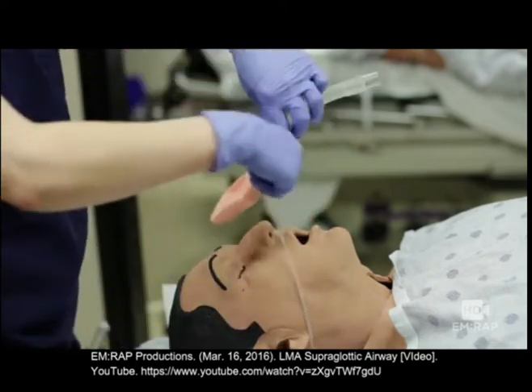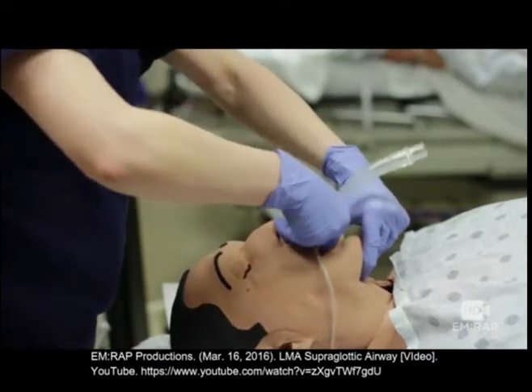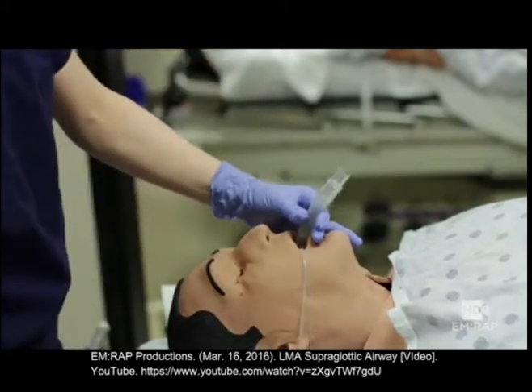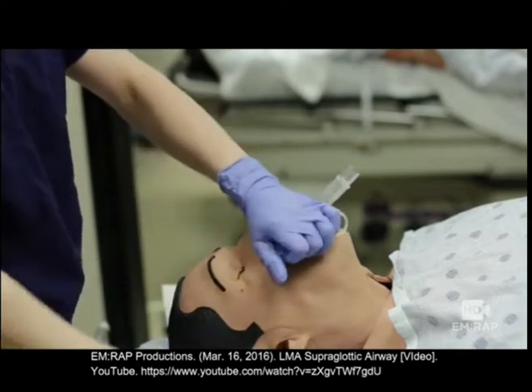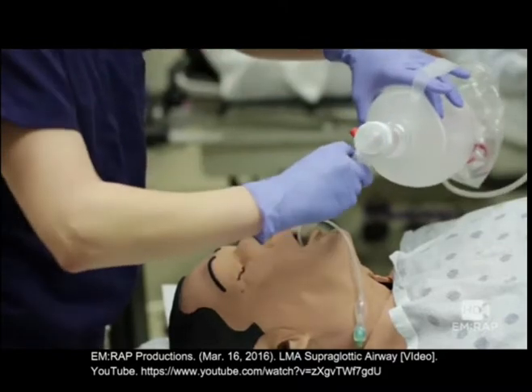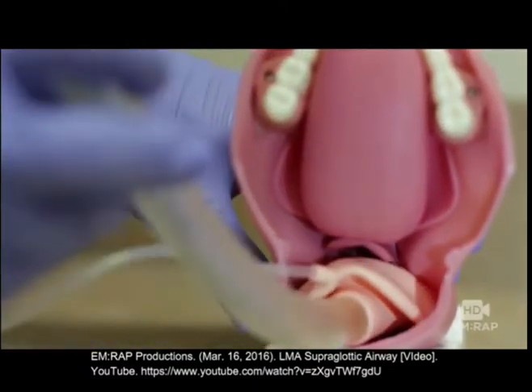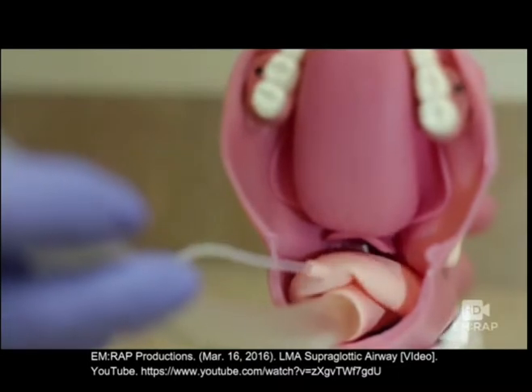And for insertion, you're going to slide it first along the hard palate, the soft palate, and advancing it into the hypopharynx. There we go. And now we can inflate the mask, and we can bag our patient. Let's take a more close-up look. The tip of the LMA is going to occlude the esophagus, and that puts the opening right over the glottis, so when you ventilate, air goes right into the trachea.